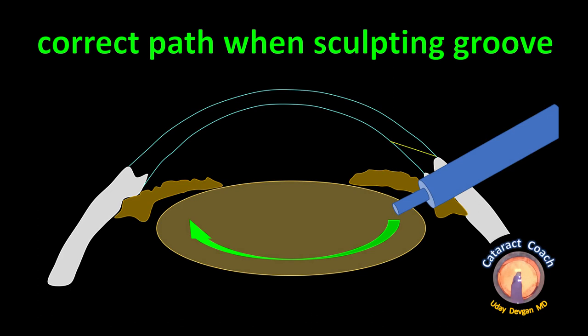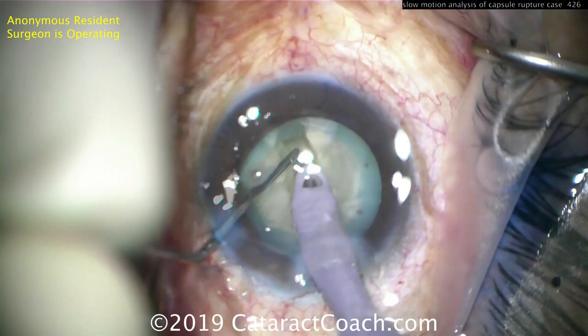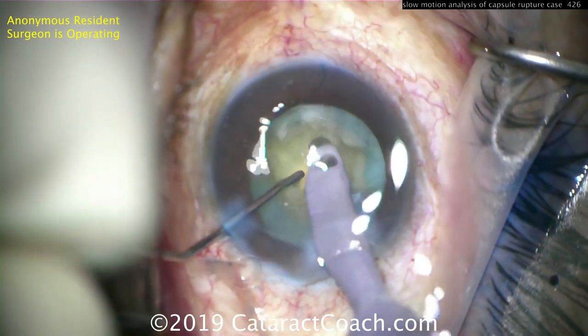What should we have done? The correct technique is to have a curve when sculpting the groove — deeper in the middle and shallower at the periphery. By doing this, we avoid letting the probe go through the nucleus and avoid hitting the posterior capsule.